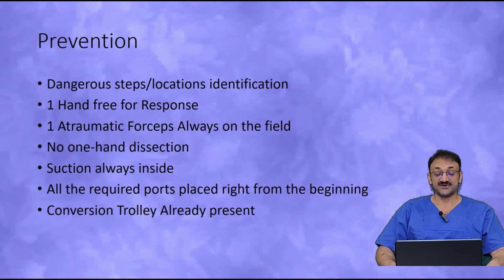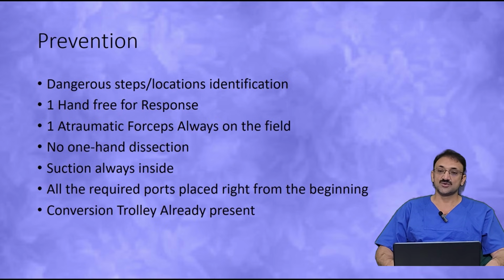Prevention is better than cure. So in face of vascular complications, it is really important that one must know the dangerous steps where the bleeding can happen. Like I said, the bleeding can happen while placing the first trocar. If you are really careless placing the first trocar, this can happen. By placing the first trocar or port with an open technique, it is already prevented.